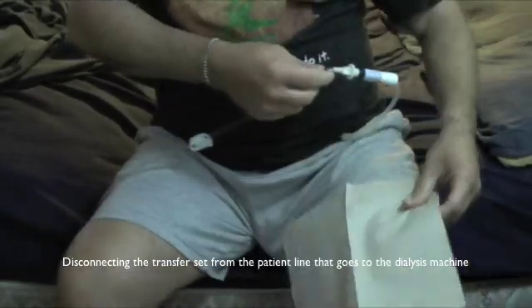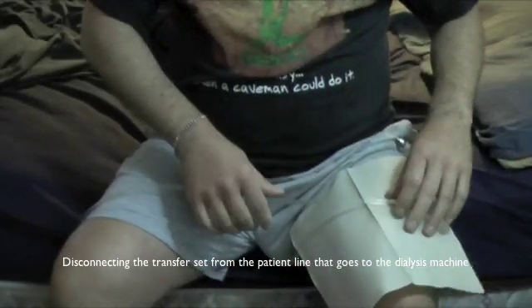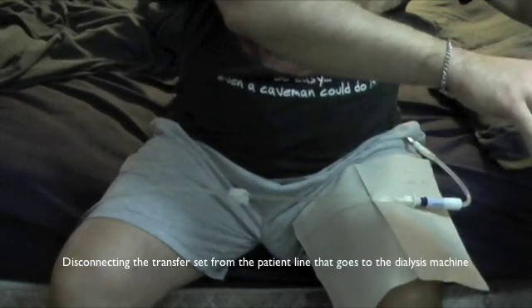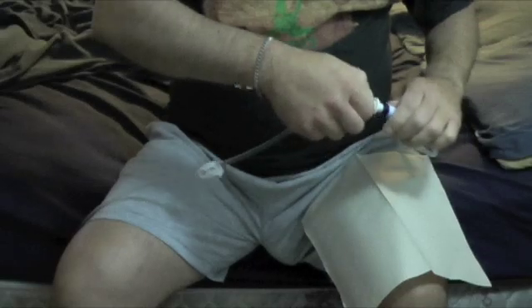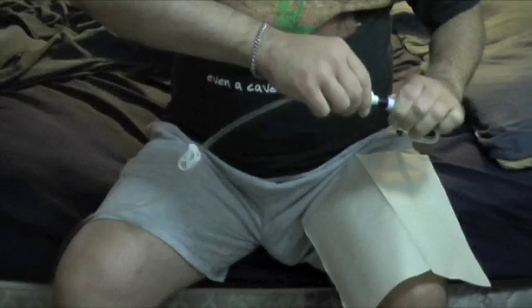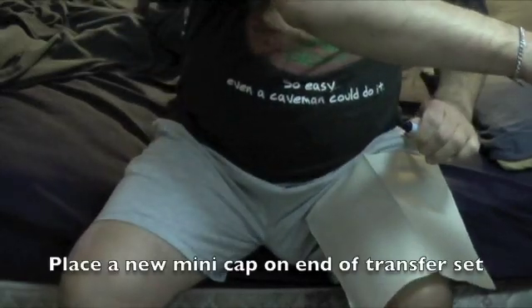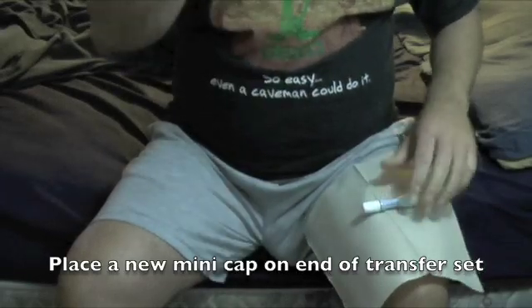Here shows how I would be disconnecting from the machine. Again, being careful not to touch anything to the end of the transfer set. We put a new mini cap on, and I'm good to go.